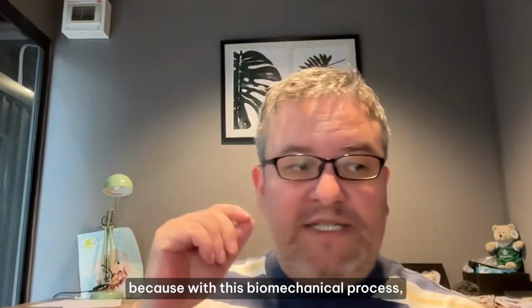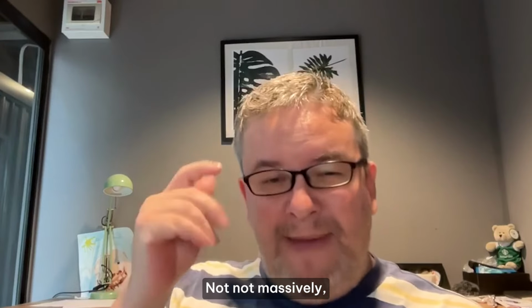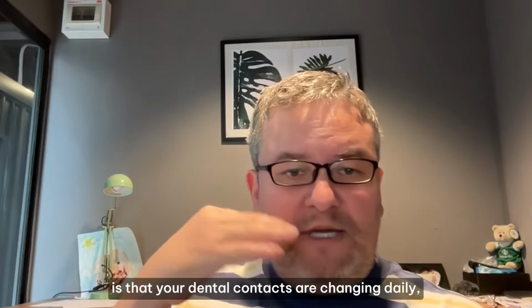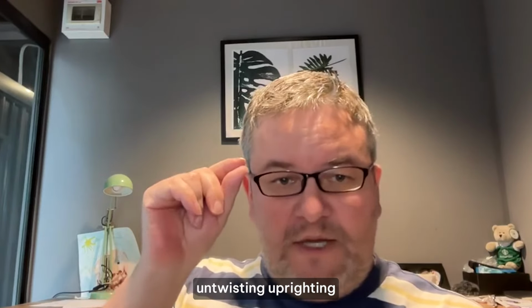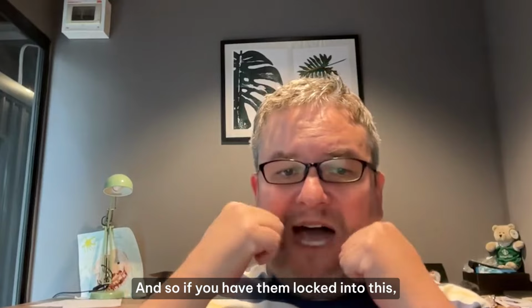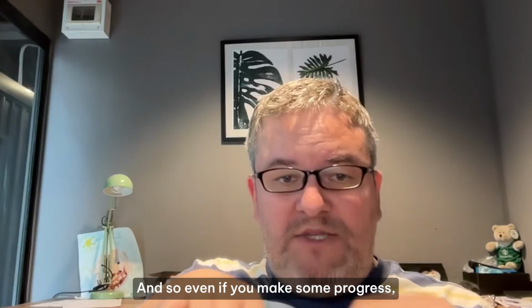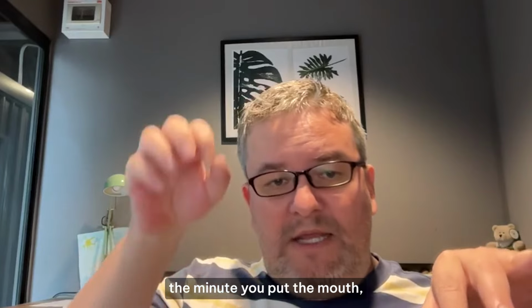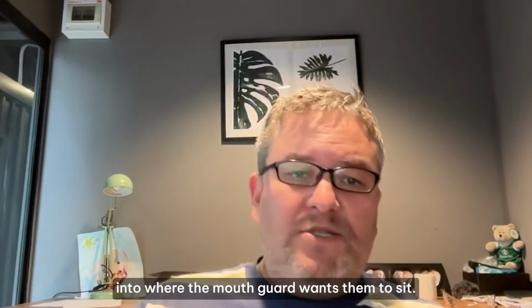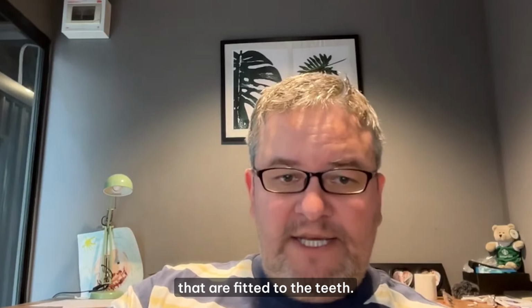And this is important because with this biomechanical process, your teeth are changing daily, right? Not massively, but like I used to test this on my tracking splints, your dental contacts are changing daily, which means that the teeth are untwisting, uprighting, your dental arches are changing. And so if you have them locked into this, for example, lower mouth guard, the teeth are going to be stuck there. Even if you make some progress, the minute you put the mouth guard back on, it's going to be pushed back into where the mouth guard wants them to sit. So I generally don't like things that are fitted to the teeth.